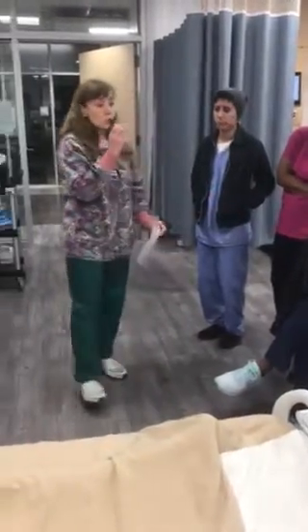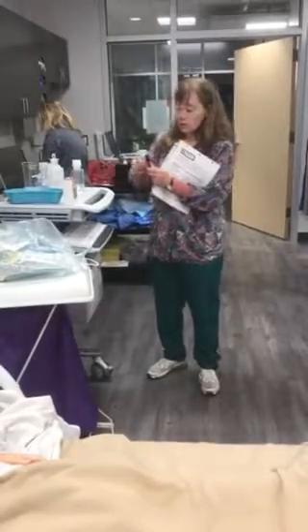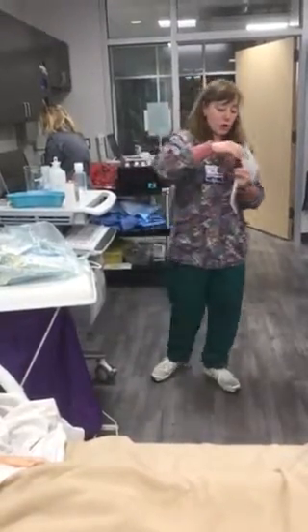One milliliter. So one of the things that we have to keep in mind is that we're going to have to put extra water in here. So then, I want somebody to draw up 1 milliliter for me.